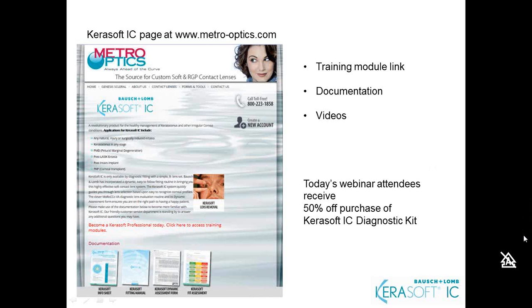Okay. There's another question, and actually, Steve, I'm going to send this one your way. The question is about the fitting sets and how long they last. Okay, thank you, Lynette. The diagnostic kits do come with a 1-year expiration date on the lenses themselves. So you want to monitor this to make sure that you keep your set within its usable lifetime.